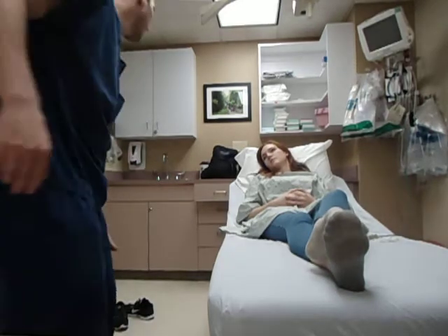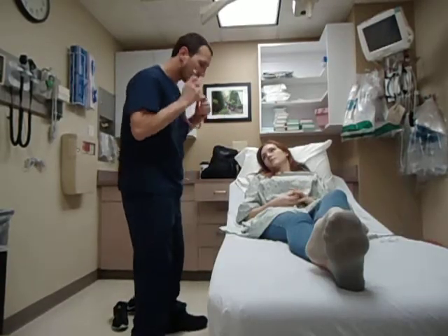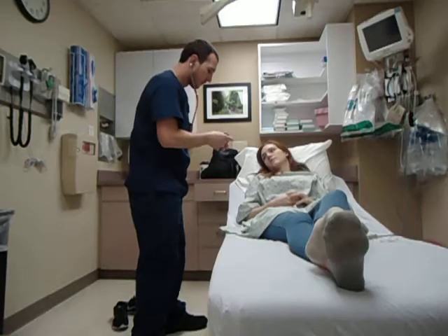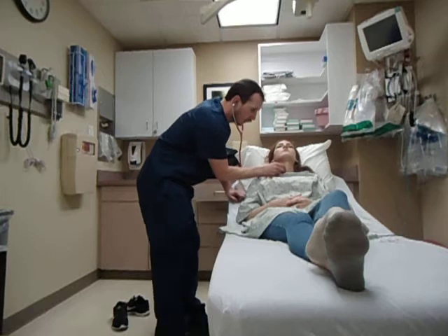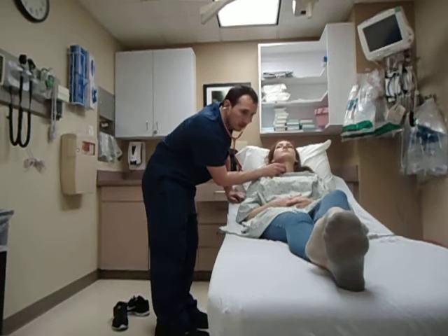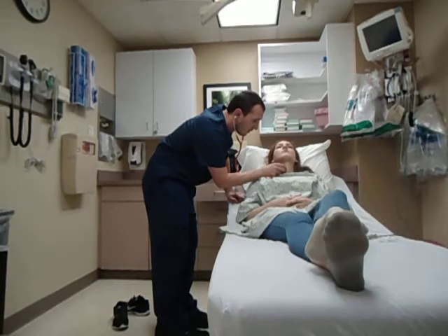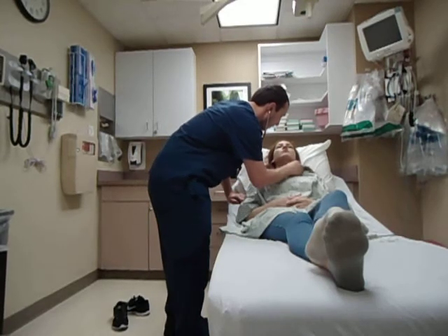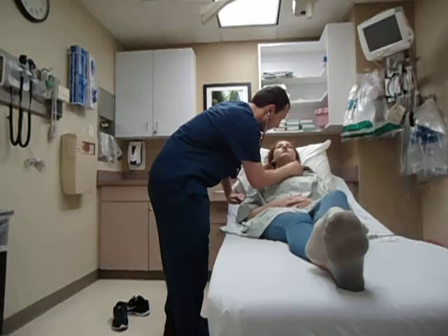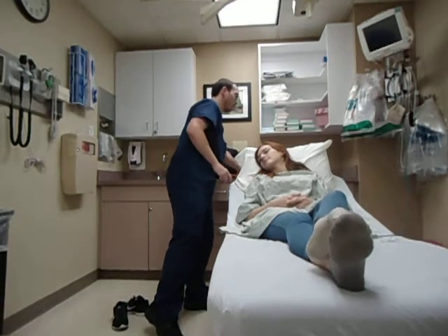And then I'll go ahead and listen to my patient's carotid arteries with the bell, listening for any bruits, and of course when I was palpating I was feeling for any thrills. I don't notice any bruits there.